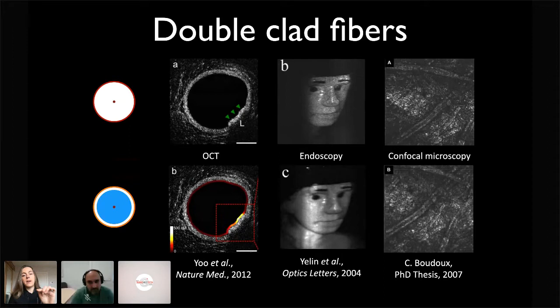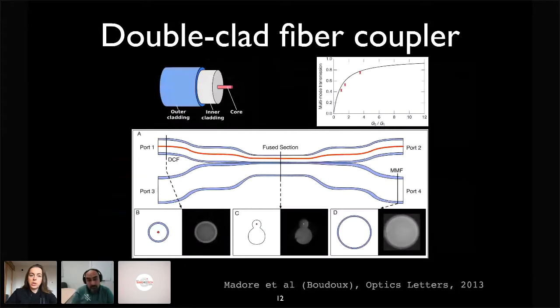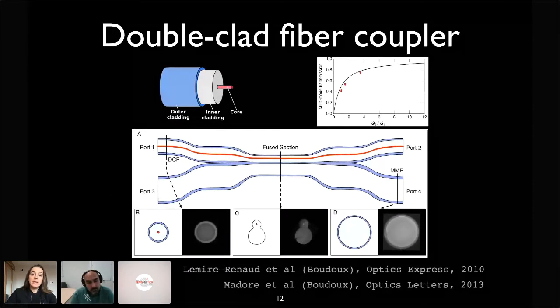and then find some molecular information. So this is where, starting with this very simple idea of an endoscope being a new laser, a fiber optics, and some imaging head, we do the imaging on biological tissue, notice the speckle, and go back to the drawing board and say, how can we make the fiber better? So this was essentially the conclusion at the end of my PhD. Conclusion is, we need better fiber couplers and we need dedicated fibers for imaging, not just to carry signal under oceans for telecom, but new fibers for imaging.